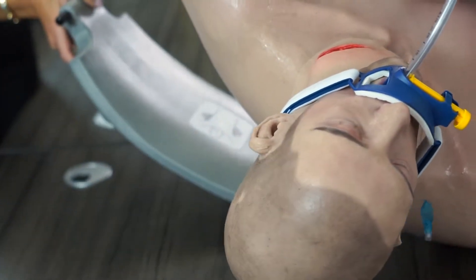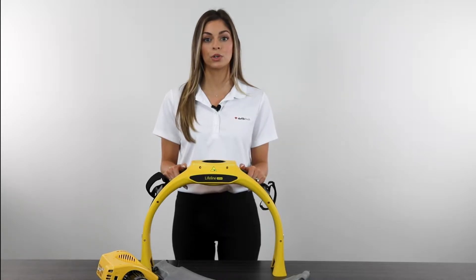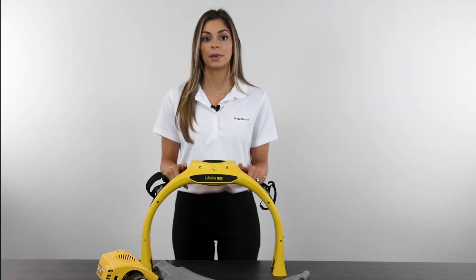The Arm is the result of years of EMS-based transport studies. DeFibTech has carefully crafted the ergonomics of the Arm and backboard to make transport smooth and straightforward, even with a patient on the stretcher. Its lightweight design helps transport from the ambulance to patient even faster.